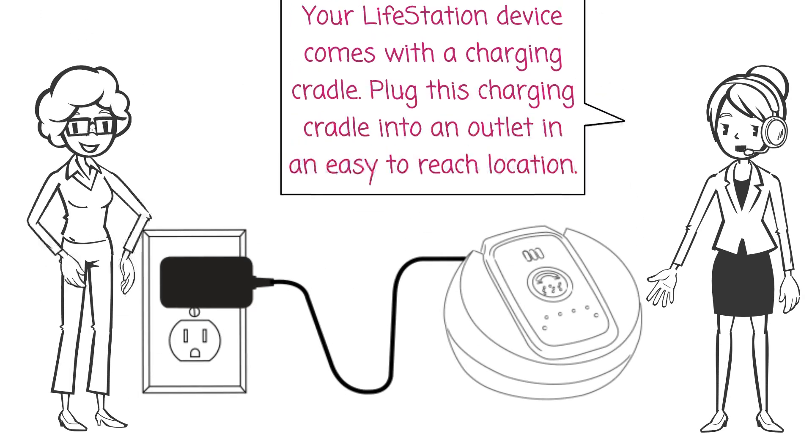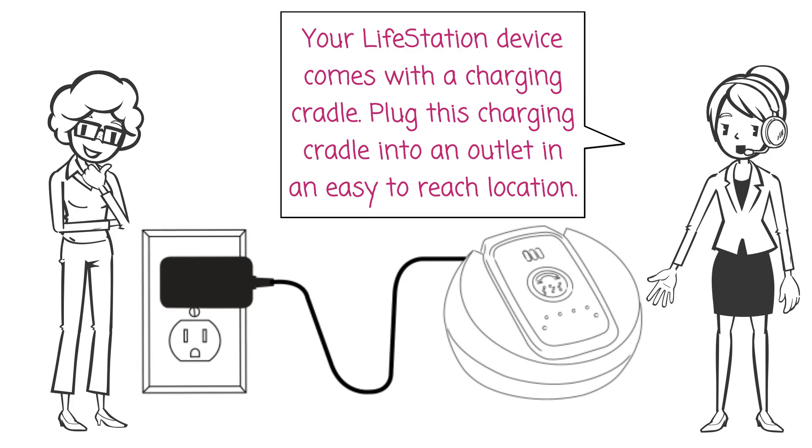Setting up your Life Station system: our Life Station device comes with a charging cradle. Plug this charging cradle into an outlet in an easy to reach location.